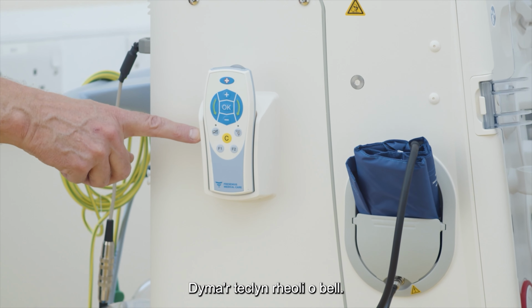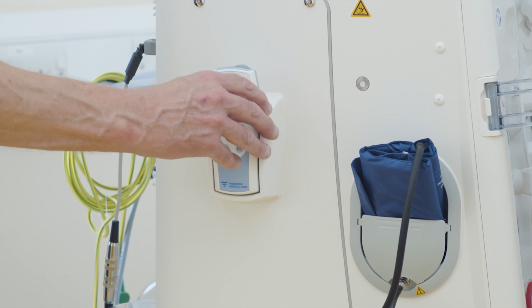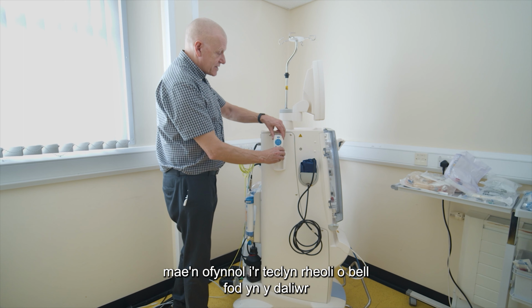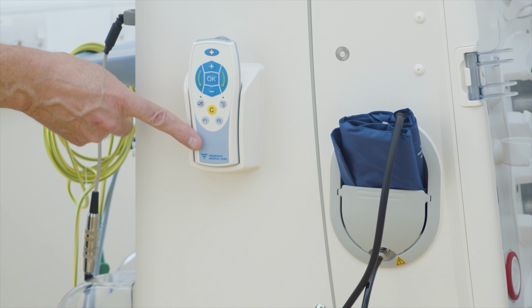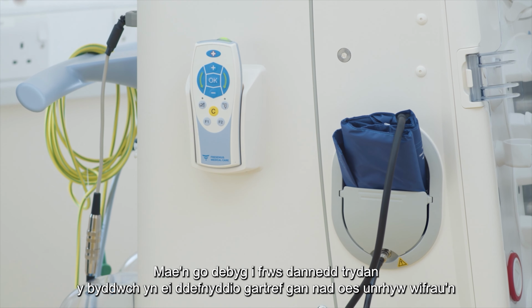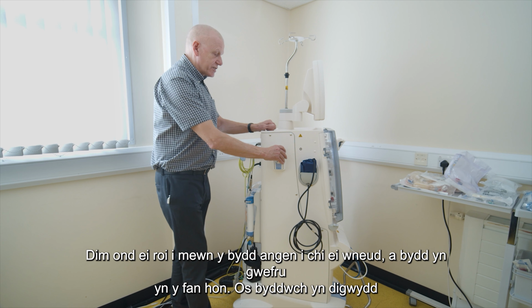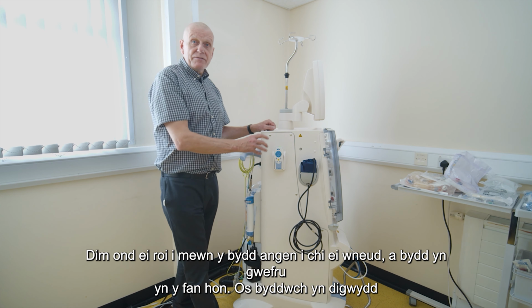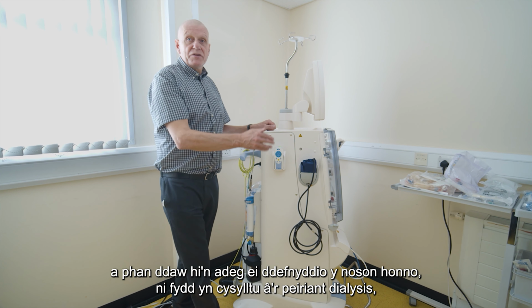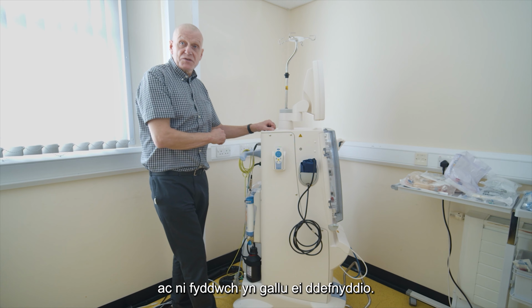Here we have the remote control. This is what you would use at home dialysis. When the machine is not in use and you are not dialyzing, this remote control needs to sit in the holder, because this is where it gets its charge. It's a bit like an electric toothbrush that you use at home. There's no wires connecting to it. You just put it in and it will charge at that point there. If you happen to leave it out, the charge will go through the day, and when you come to use it that evening, it won't connect to the dialysis machine and you won't be able to use it.